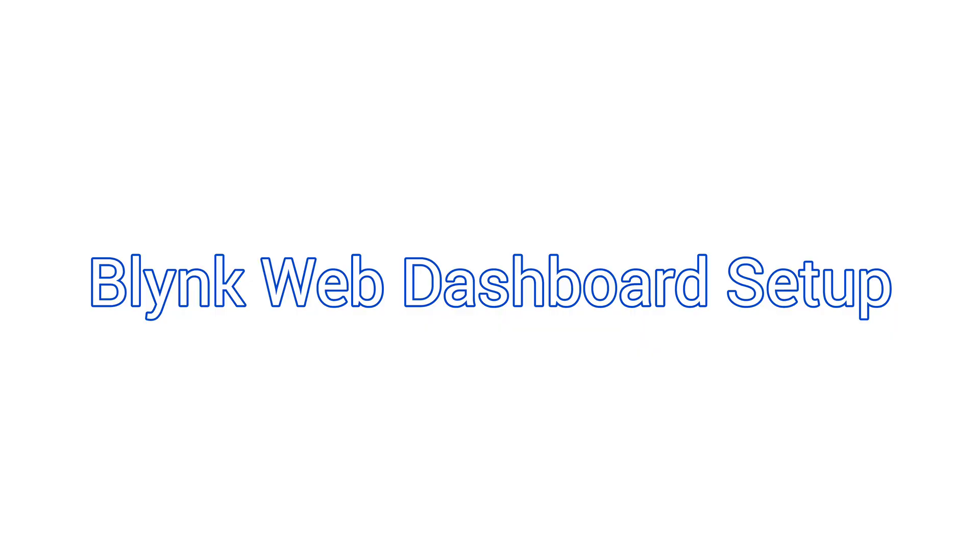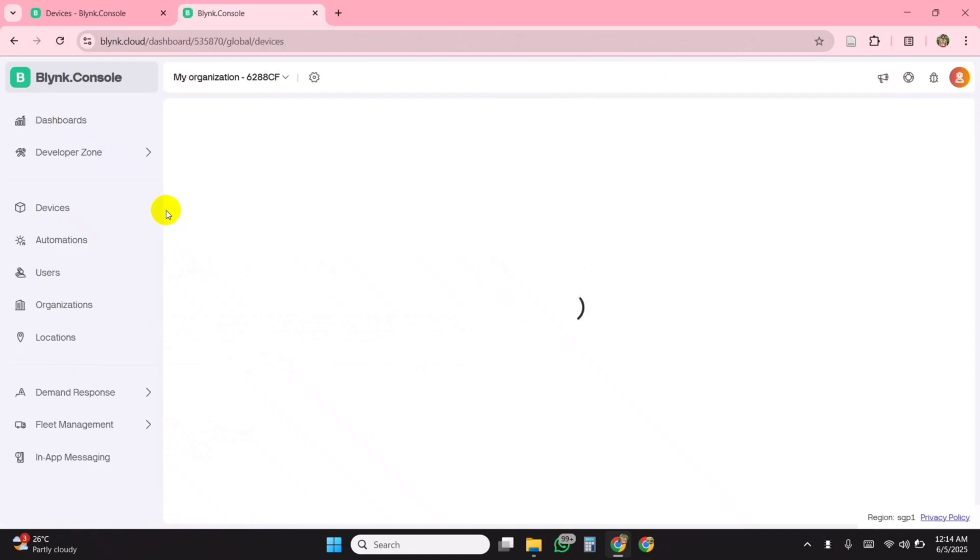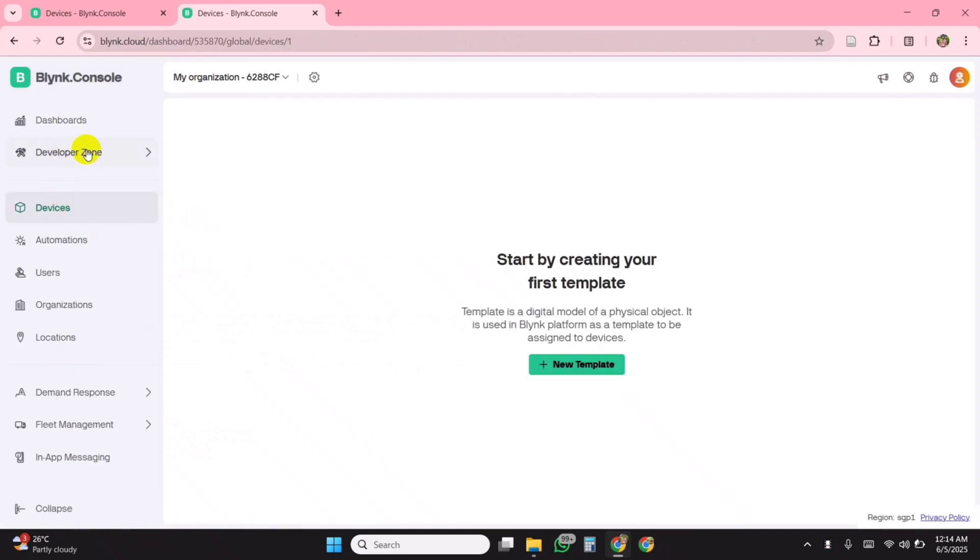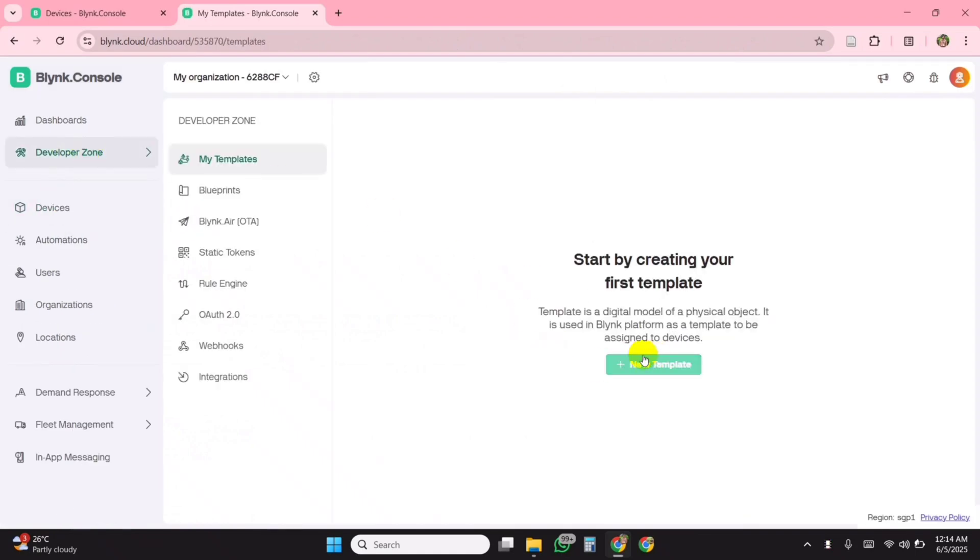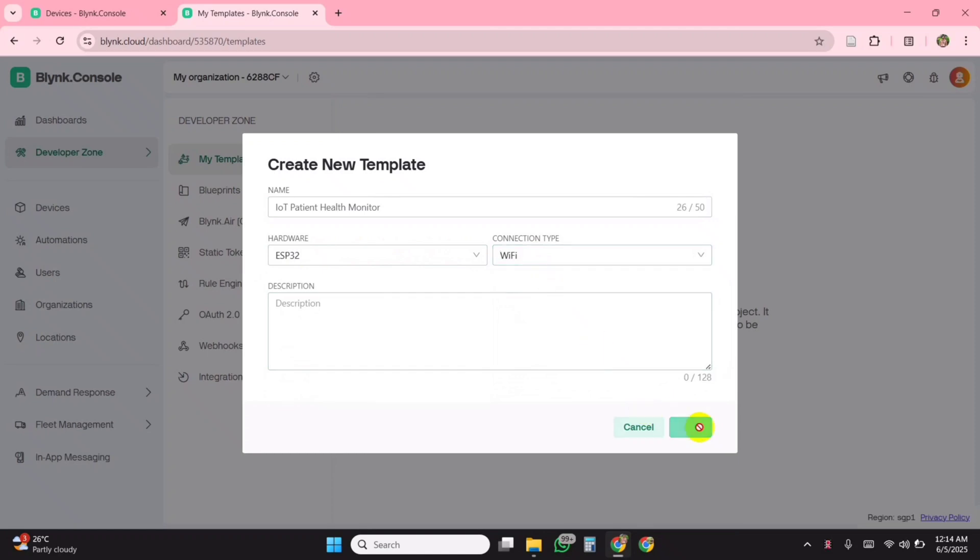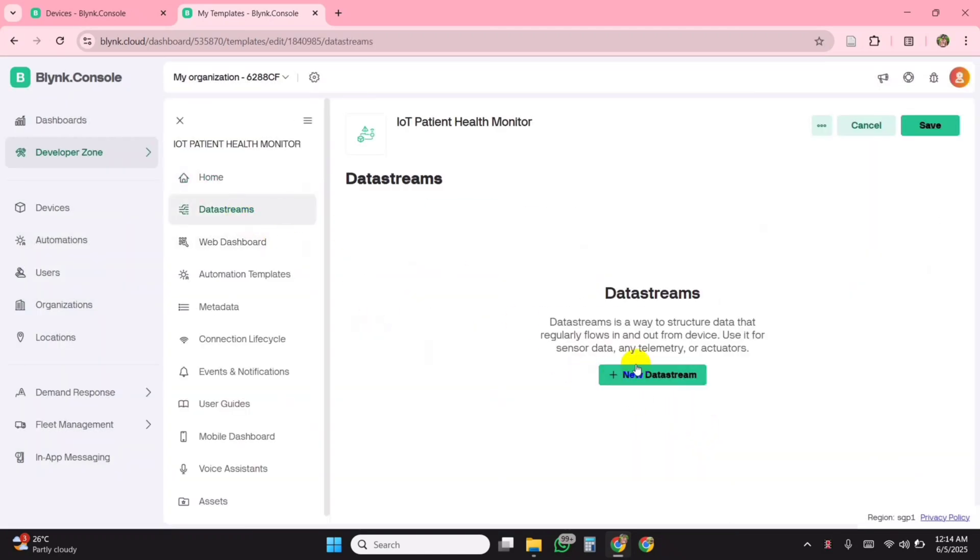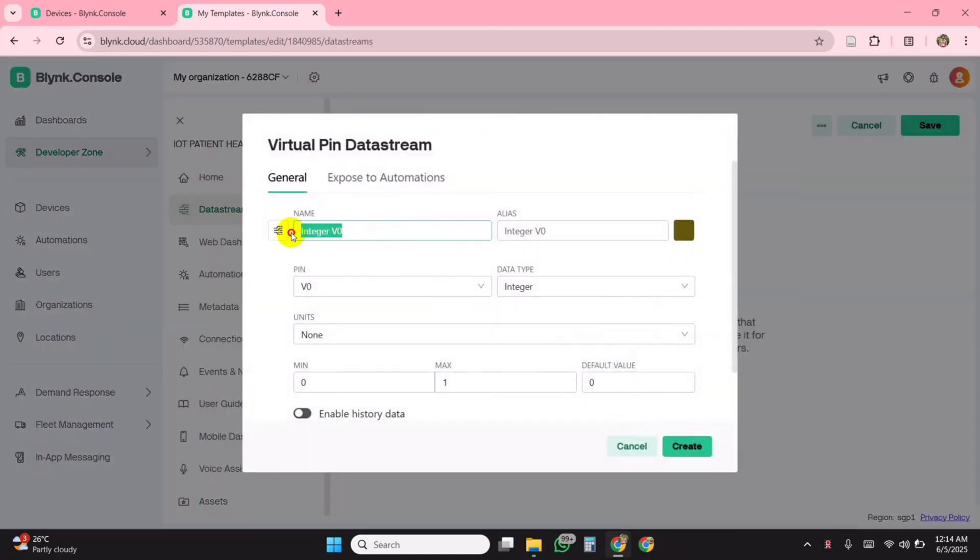Now let's move on to the Blink Web Dashboard Setup. Visit the Blink website and create a new account if you haven't already. From the Developer Zone, create a new template for your project. Then, create four virtual data streams, one for each of the parameters we want to monitor.